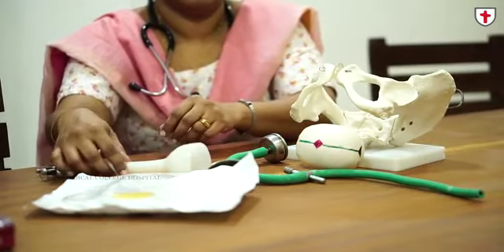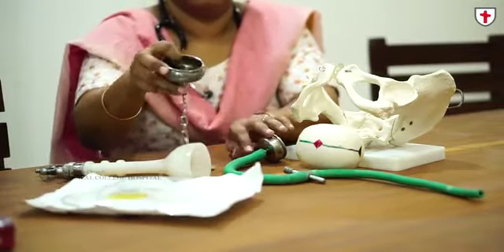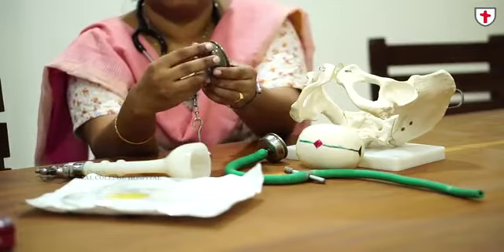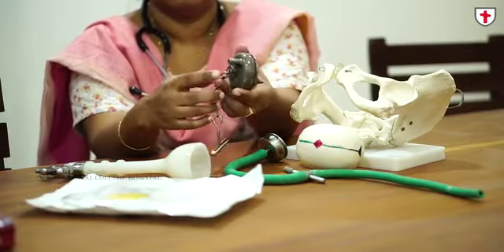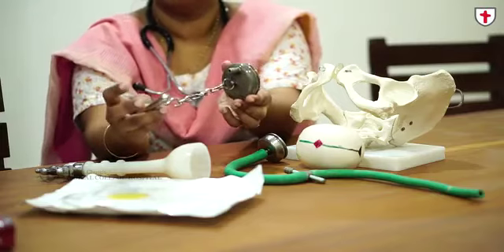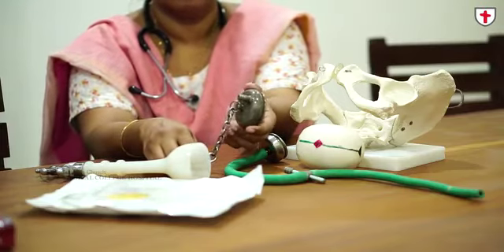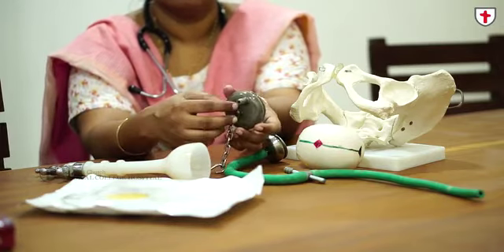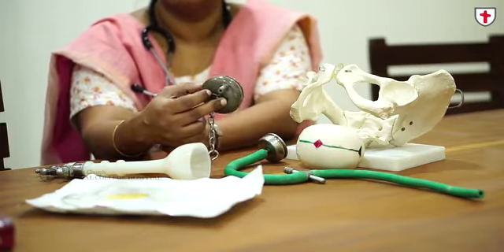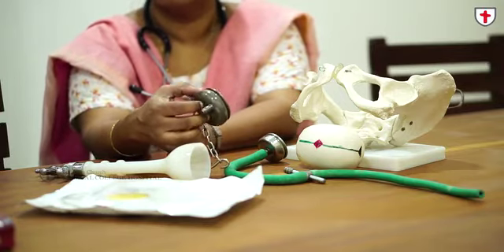There are various versions of the metallic cup. We have the OP cup where the negative pressure tubing is on the side. In the standard cup the pull is on the central part. In the OP cup it is on the side, and this is known as the Bird's cup, which enables auto-rotation in OP positions.